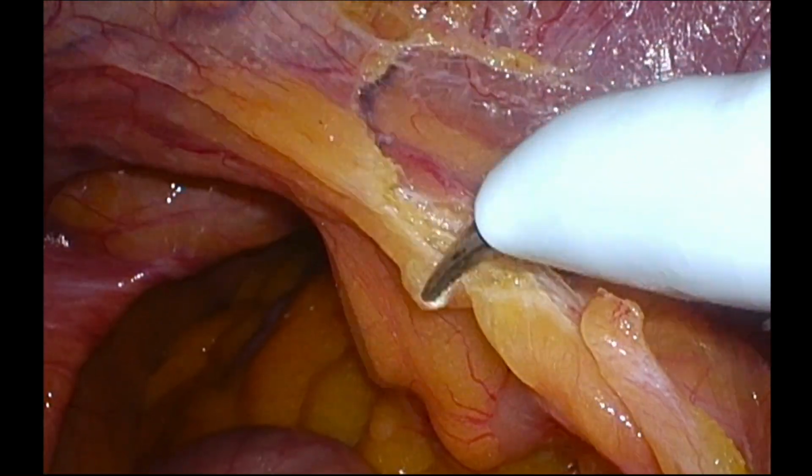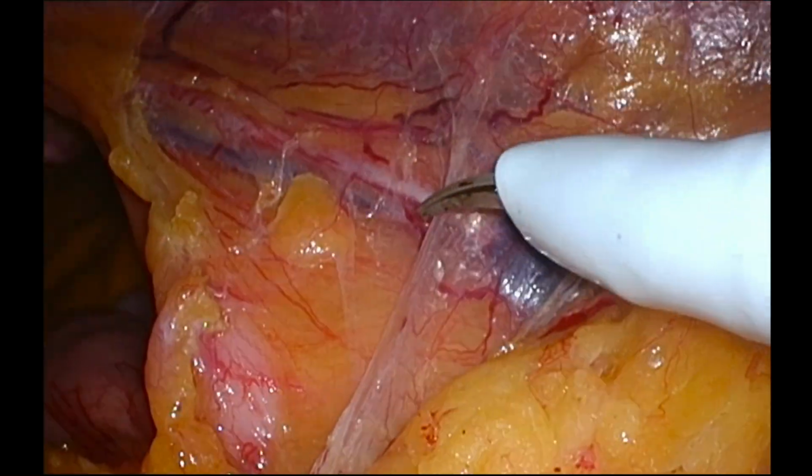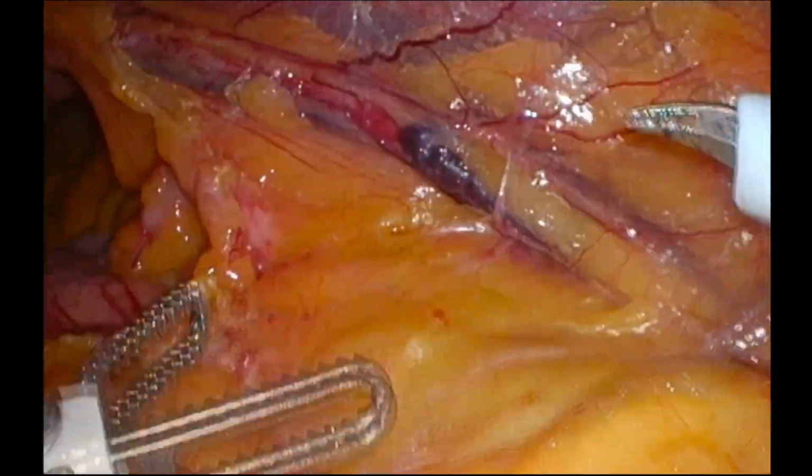The colon should be adequately mobilized so that the gonadal vessels and ureter are seen at the caudal end, and at the cranial end, the duodenum is visible.